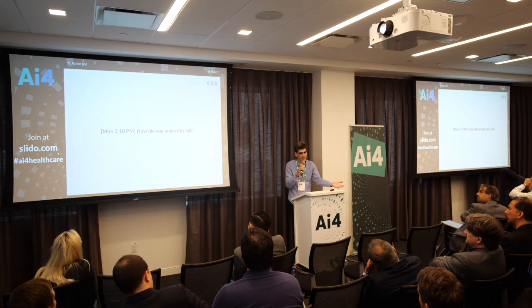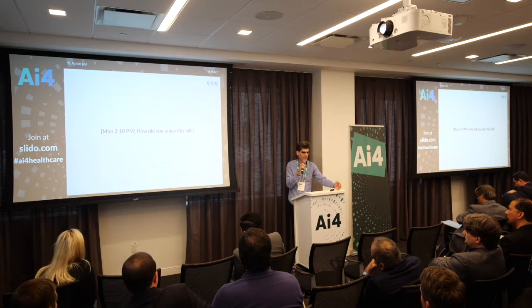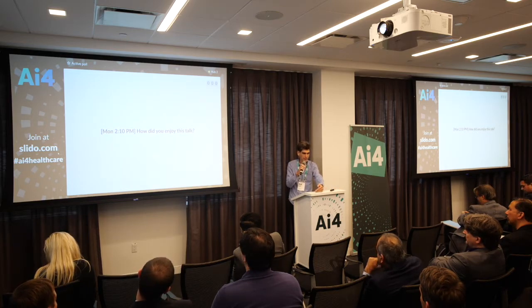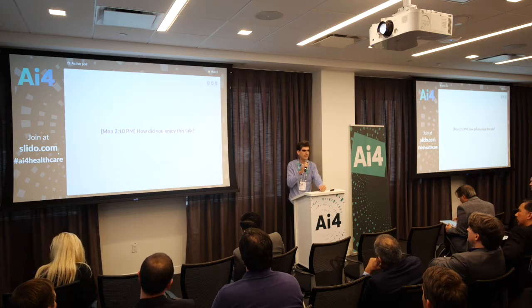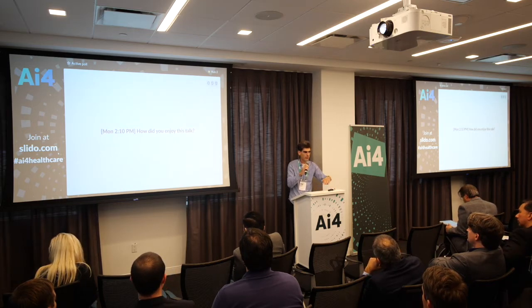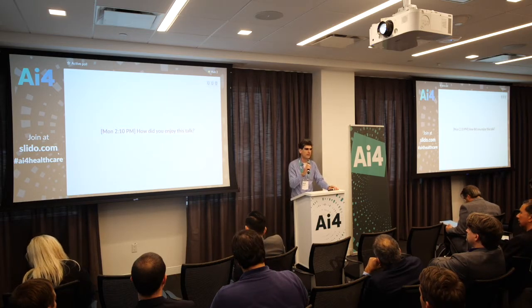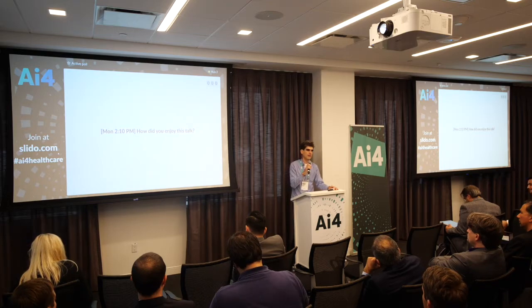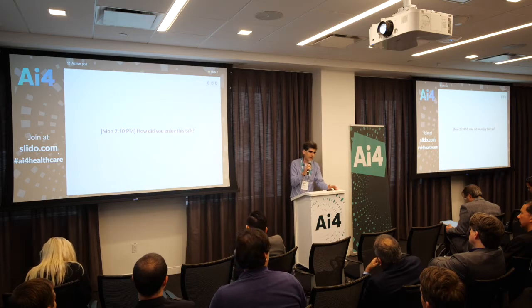We don't write the layers ourselves because there's no need, but there's lots of nuances and details that go into the network architecture and the type of ways you try to overcome overfitting and issues such as that. And more than that, many nuances go into the training process of the network: what type of examples to show it, how to do the augmentation, etc. So we don't think it's good enough to use an off-the-shelf platform. But the technology itself and the libraries that are used for it are very accessible.